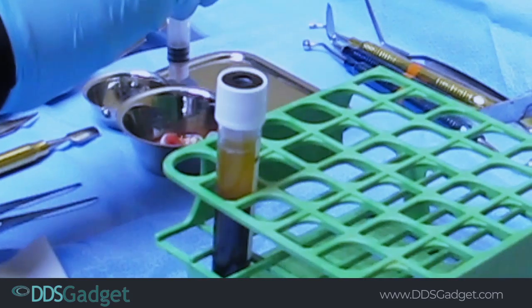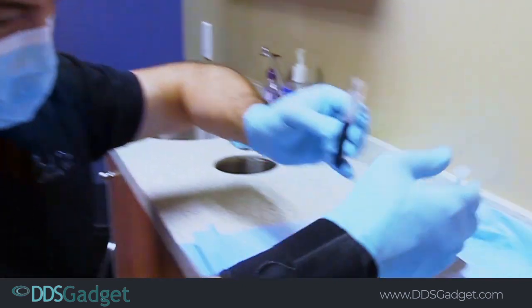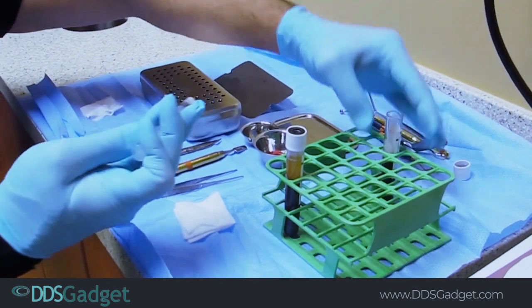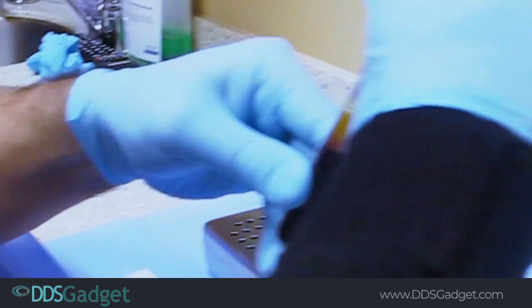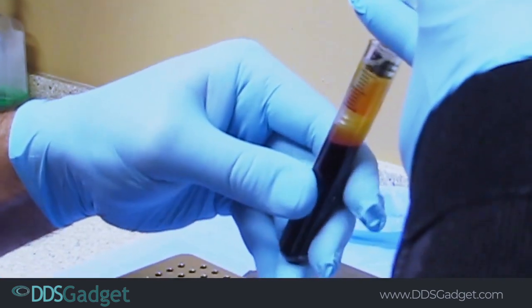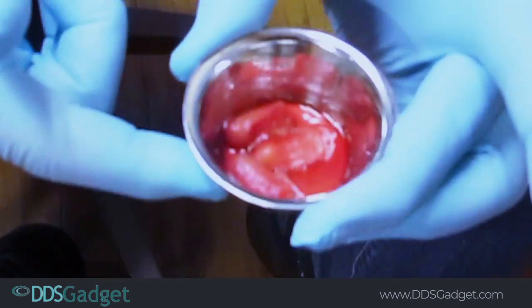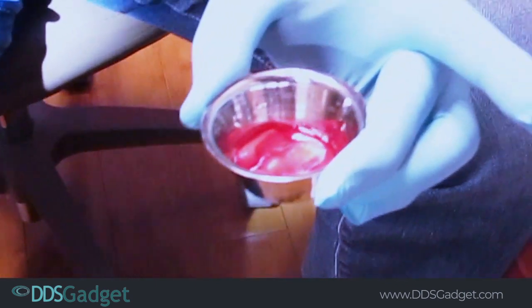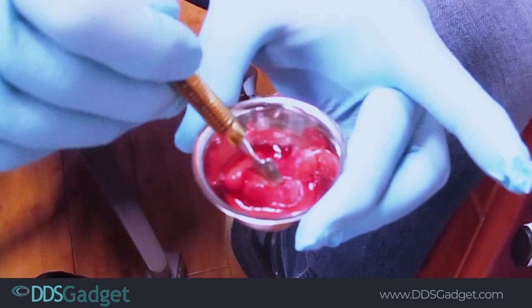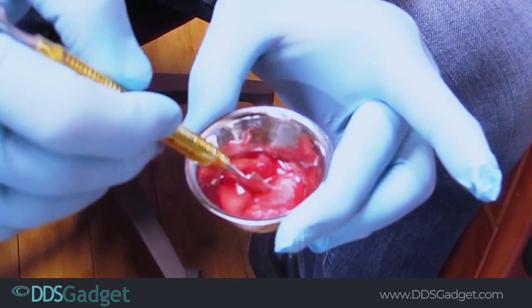Here it is and I'm just going to pour that in there and grab the rest of it. We're going to do the exact same thing on this tube — you can see the nice separation here. The top portion is what we want. This is also how you would make sticky bone — here are the collagen plugs soaking in IPRF, but you can also do this with bone and you'll see how this becomes nice and jelly-shaped so it's easier to pack and place.